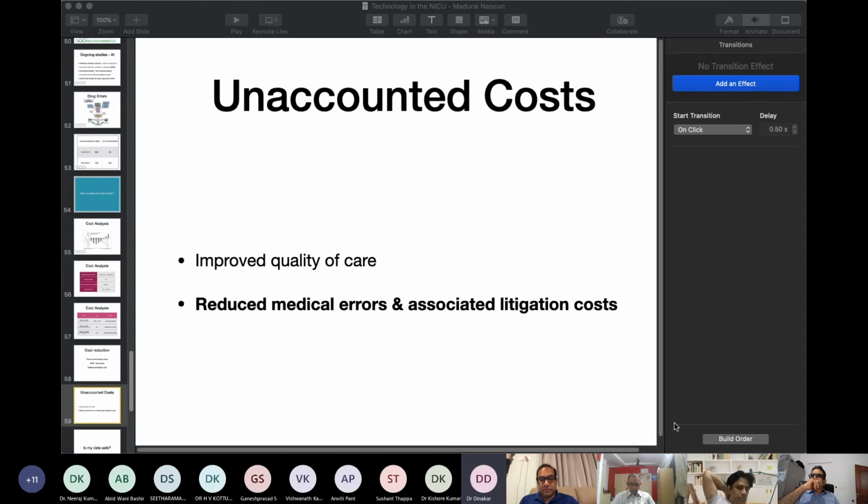Nowadays, we will only tell our nurses to put the SpO2 and so on. I think Suresh told he is going to take some Suntech people. In Suntech, NIBP is there. Suresh should take her in the line, then she will guide us. Because in Suntech NIBP, we have to give 30,000 extra only for neonatal, pediatric or adult BP. Their system is not like the oscillatory method that all the machines use to give BP. Theirs is not exactly oscillatory, but more accurate.